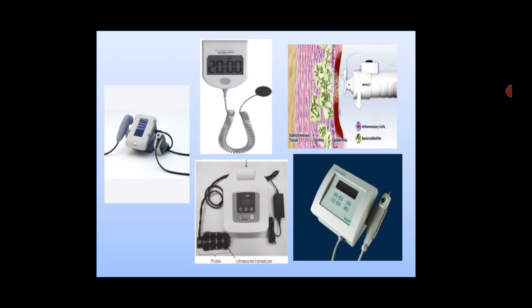Then coming to the third type of ultrasound, that is non-contact low frequency ultrasound, where we use lower frequency with a lower intensity range. We use sterile saline water contained in a bottle as a coupling medium. It is mainly used to promote dermal wound healing.